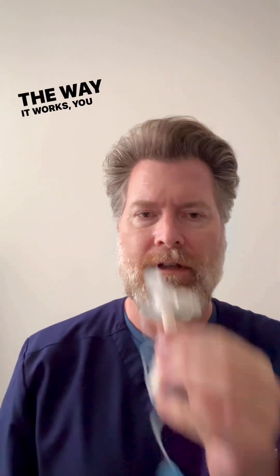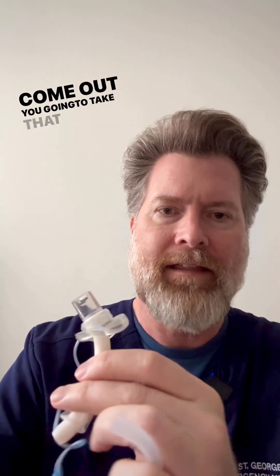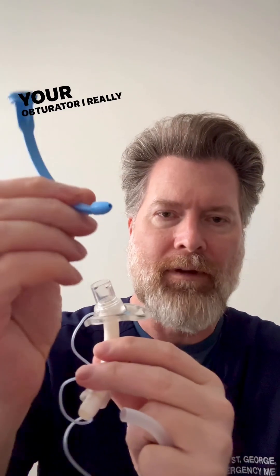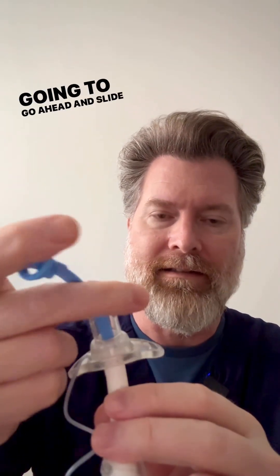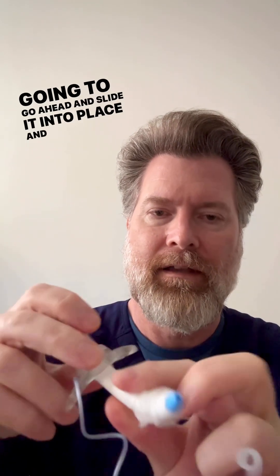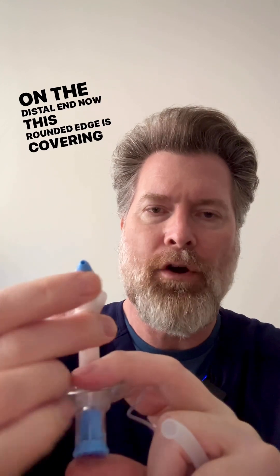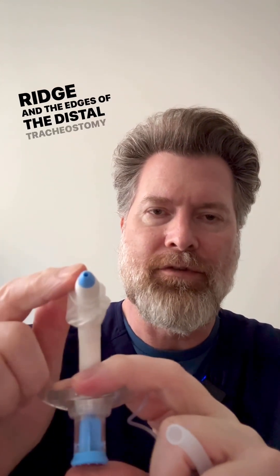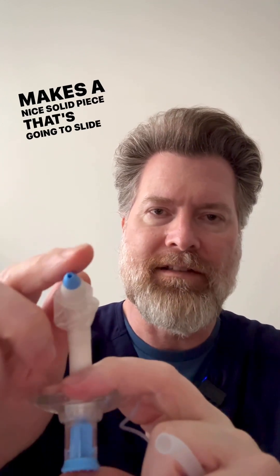The way it works: you take your tracheostomy tube — usually the inner cannula is already in there — that's going to need to come out. You're going to take that out and then take your obturator. I really like this one because it's a different color so you can recognize it, and then you just go ahead and slide it into place. On the distal end, this rounded edge is now covering over the ridge and the edges of the distal tracheostomy tube, so it makes a nice solid piece that's going to slide easily into the stoma without causing injury.